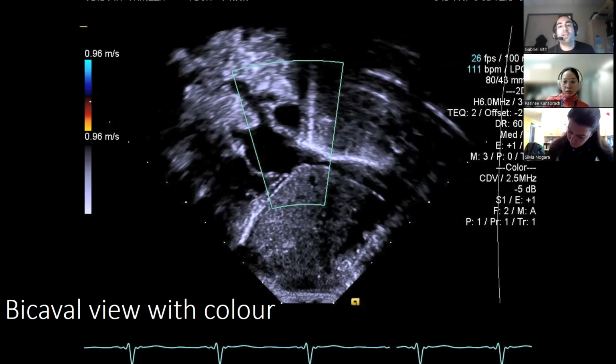The importance of seeing the IVC is that, first of all, you want to make sure that there is one. Second of all, it allows you to visualize if there's a line or not in the IVC. And it is also a good view that we sometimes use to get an indirect assessment of what's happening in the right atrium. So if it looks very juicy or dilated, it might be that your right atrial pressure is a bit higher. It might be that your filling is good, or it could be because you're in RV failure, or it could be because you're mechanically ventilated.